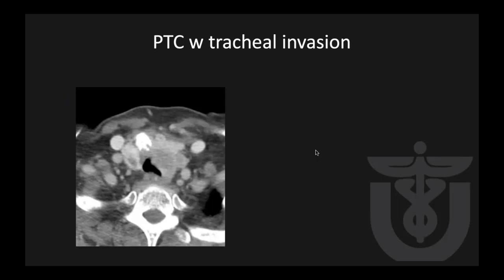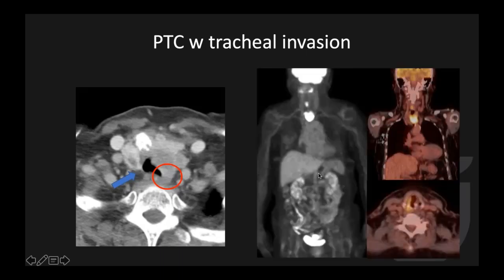Here is another case of papillary thyroid cancer with tracheal invasion. Notice the deformity of the tracheal wall. Normal TE groove shows nice fat, but on this side the fat is completely obliterated — there is no distinction between the lateral wall of the cervical esophagus and the tumor. This explains the PET finding of abnormal uptake within the right true vocal cord because the right true vocal cord is doing all the work — the left side is completely paralyzed.